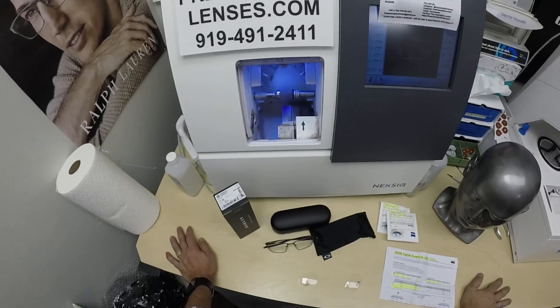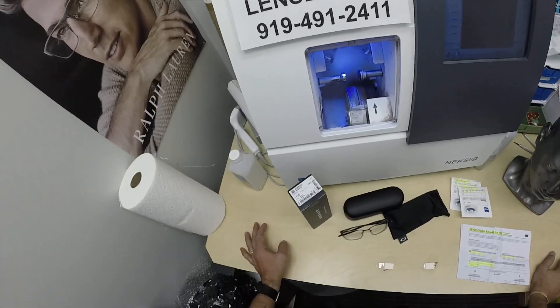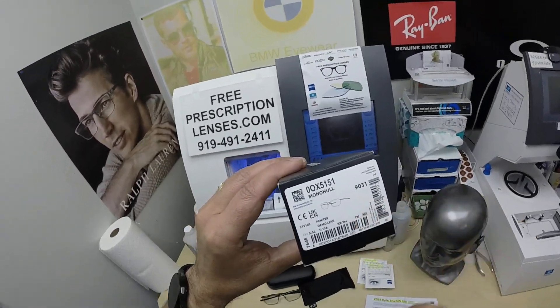Mo Better, because I'm going to have you seeing Mo Better, looking Mo Better, and show everyone else how to bring that loving feeling back to glasses when I show you Dan's Oakley 5151 Monohull.